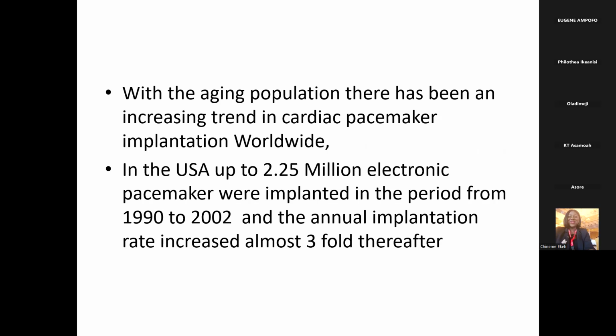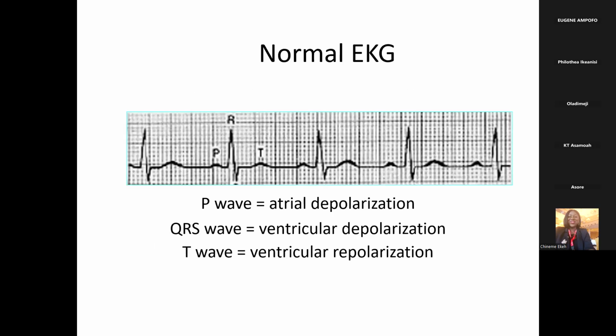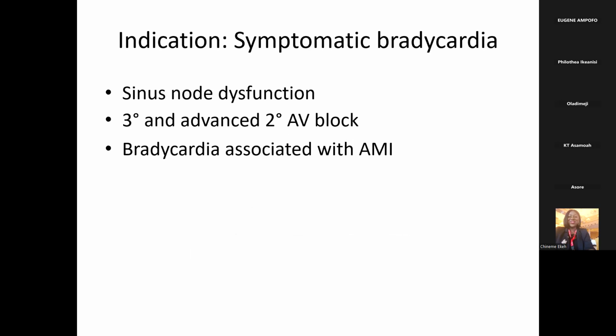We all know that the need for pacemakers is increasing since there's more awareness, and we should also know that apart from pacemakers, we also have other implantable devices, which we're all aware of, ICDs and CRTs. So I'll just skip many slides so as to save time, so we can ask questions and modify information.